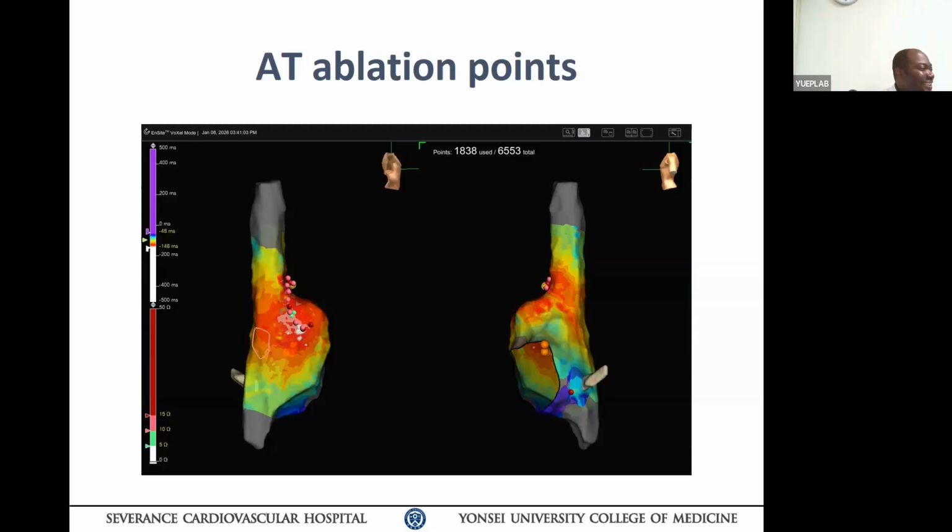That's crazy. No. So I think from a teaching standpoint it is important to recognize what structure you're ablating, where you are, and what the potential complications are. I can only tell you guys what not to do, okay? You can do anything else you want. All right? So please map the sinus node.